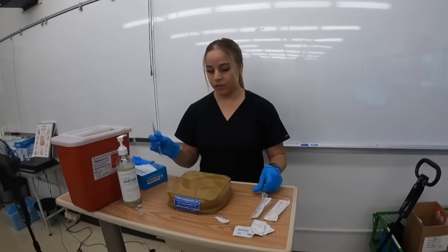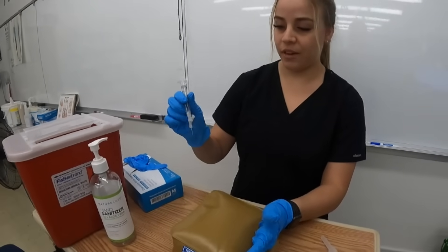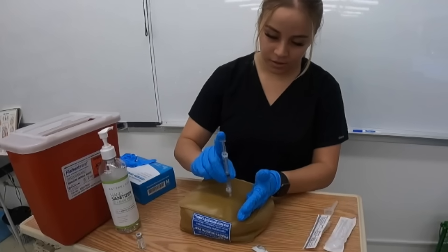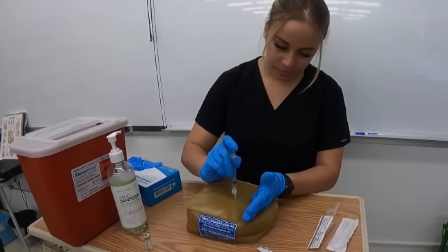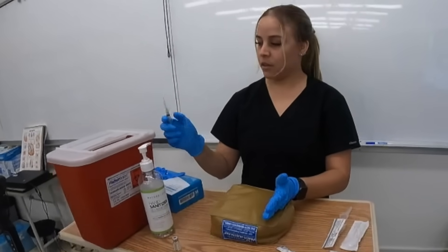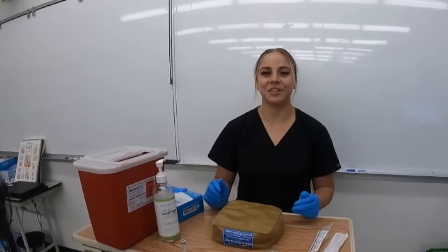Using the Z-Track method, at a 45 to 90 degree angle, I'll use the dart method and insert the medication, then activate the safety and dispose of the syringe, needle, and container.